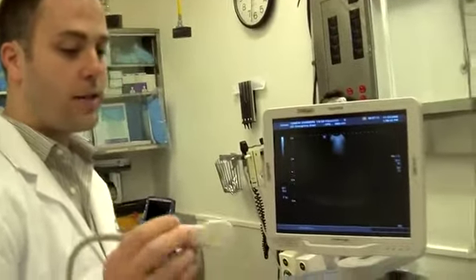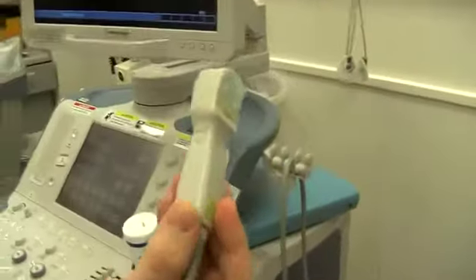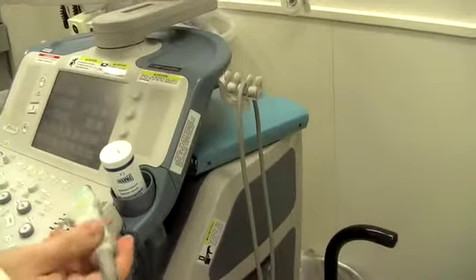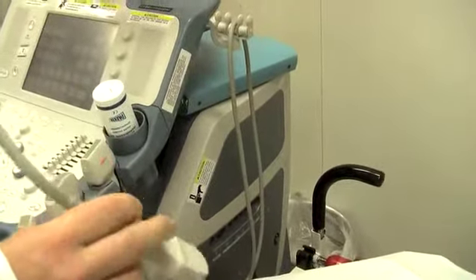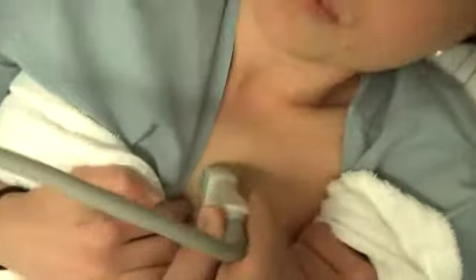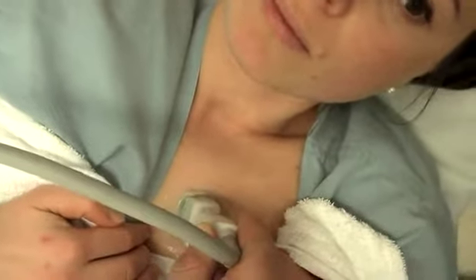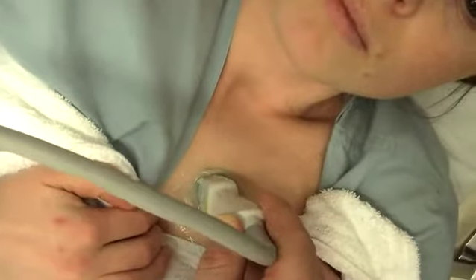So remember when I was telling you guys earlier about the indicator being always to the right of the patient's head? Well, this is the one instance where the indicator actually will go to the patient's left. For the parasternal long axis view, you're going to go either the second, third, or fourth intercostal space, very near the sternum. You'll be almost on top of the sternum, and then you'll slide over into the intercostal space, maybe about a centimeter or two to the left of the sternum. You want the indicator to the patient's elbow, okay?